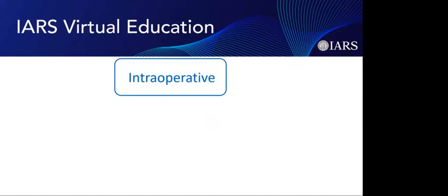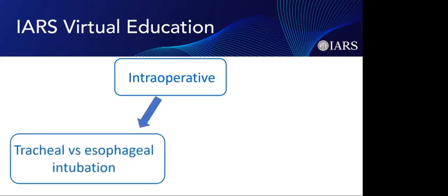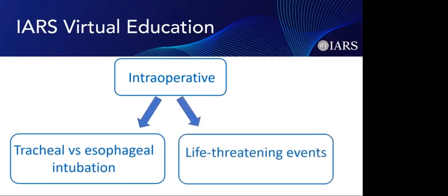Furthermore, intraoperatively, POCUS can be used to differentiate between tracheal versus esophageal intubation, and also to diagnose life-threatening events where the appropriate management can be provided.